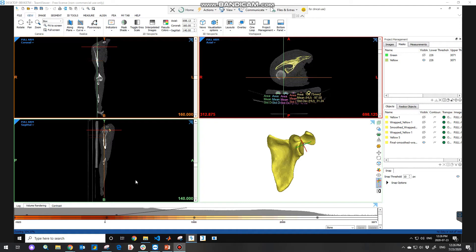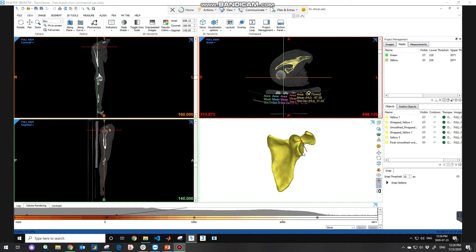This is the GUI environment of the software including axial, coronal and sagittal view of your images. In the bottom right view is the 3D window which will contain all of the 3D models we're going to create.